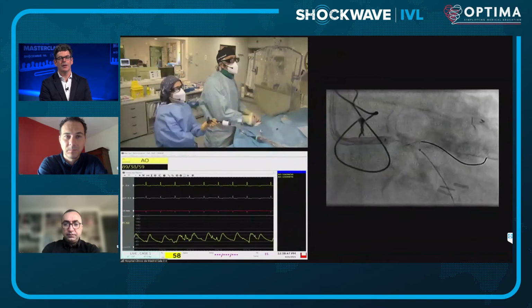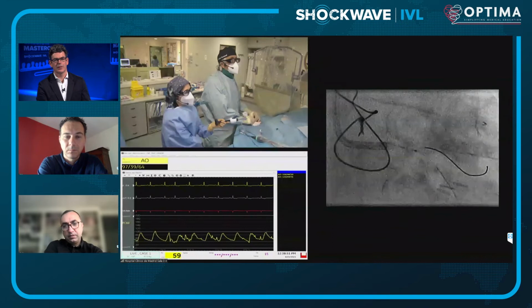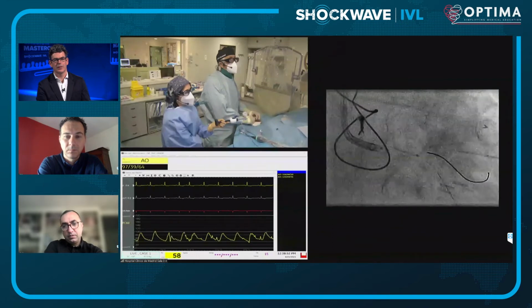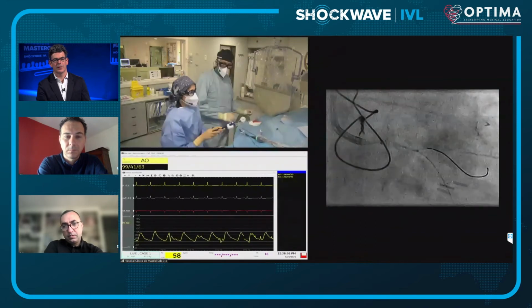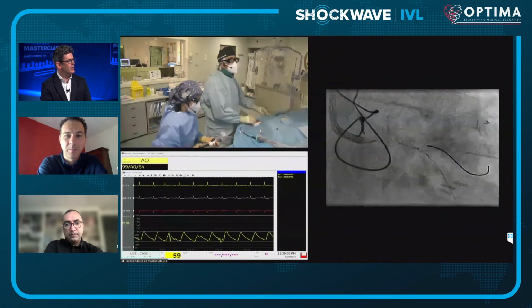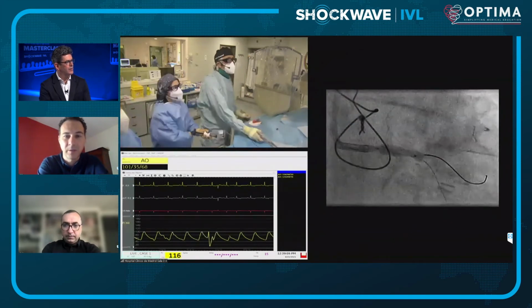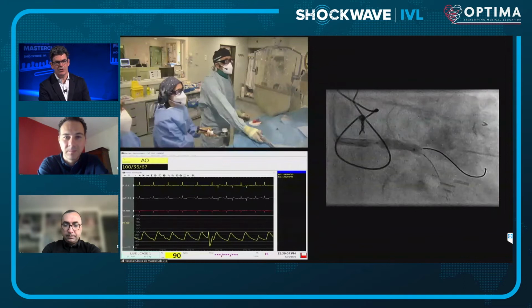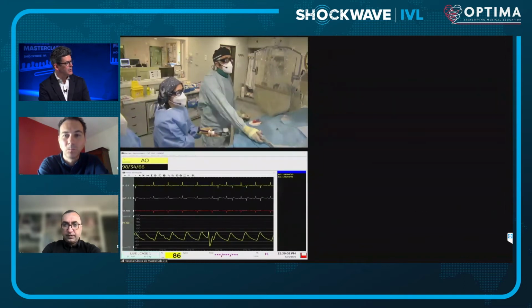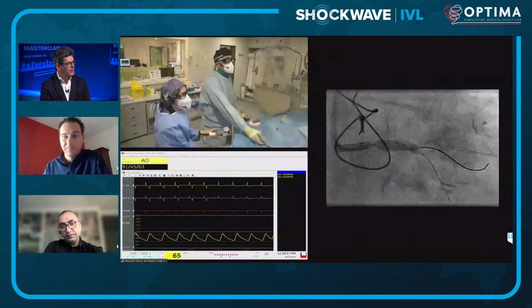You can see that from that. So I think actually, you could see in angiography that it's a region where you have calcium above and below the balloon. So it's this region that really needs some more pulses. And that's a big advantage of shockwave to have a side branch PCI wire. So this shows the apposition within the left main and the distal constriction in this balloon. So you're right over at one of the emitters now. So perhaps you could film that again and we may see some expansion.